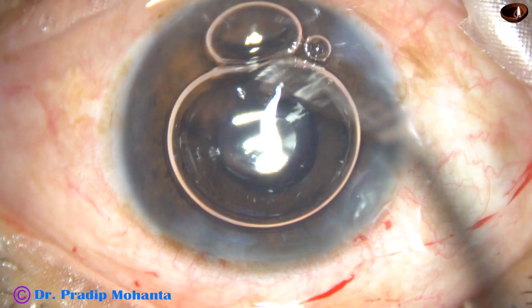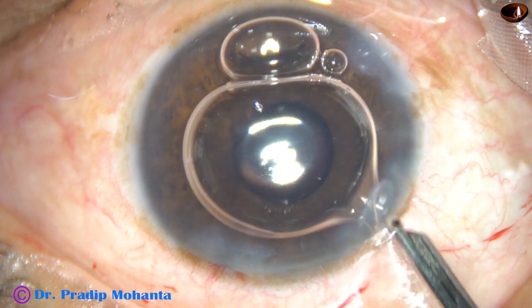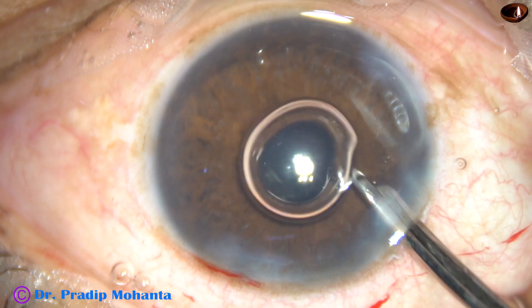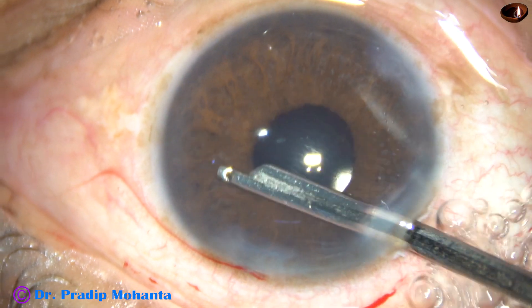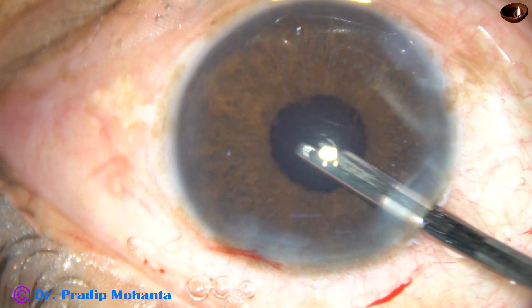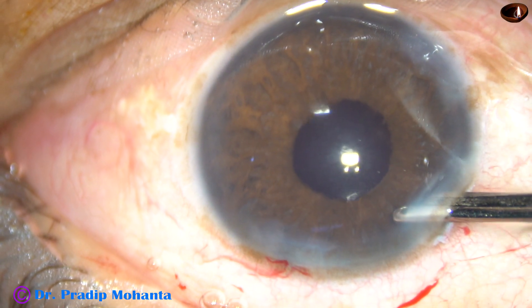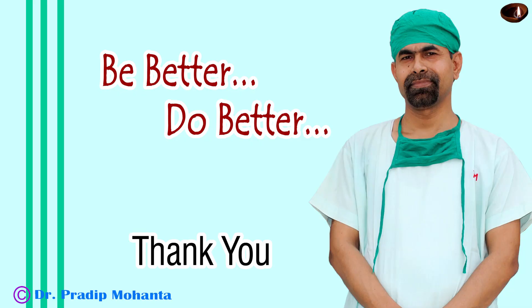An air bubble has been used to maintain the anterior chamber. Whenever you find that the anterior chamber is becoming shallow, use an air bubble — it will maintain the intraocular pressure and the anterior chamber. And now this is the final lavage of the anterior chamber. The anterior chamber is formed very nicely. All the wounds are checked and then the case is concluded.